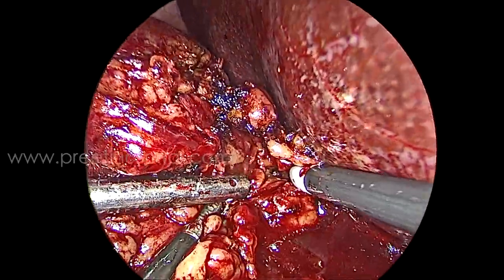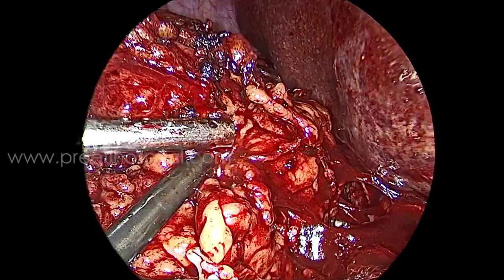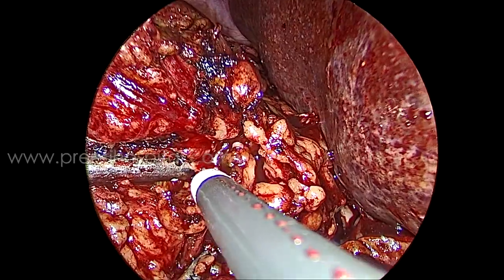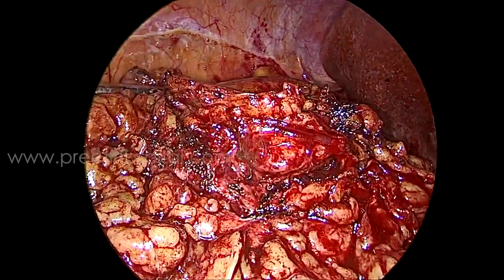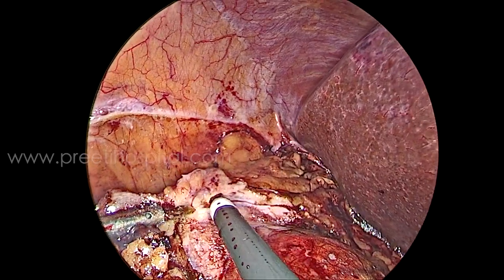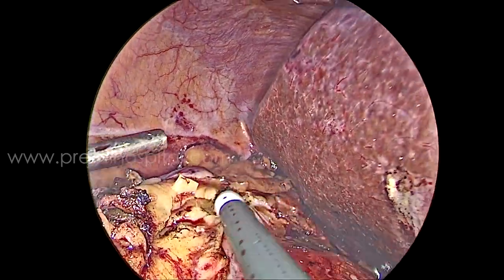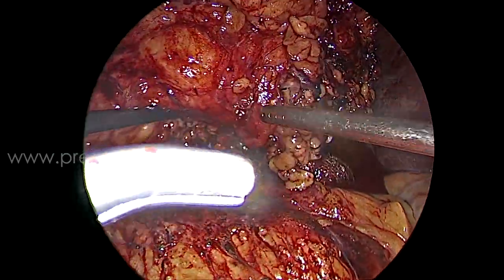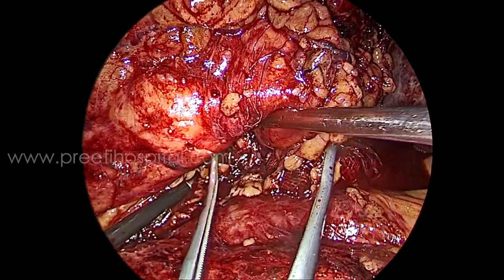Continuously someone is sucking and there is nowhere a plane between the capsule of the kidney and the perirenal fat. We thought we would go to another area — there also it was the same thick fat. Can you imagine such thick, inseparable fat? We had no choice but to imaginarily take one angle after reading the CT again and again.